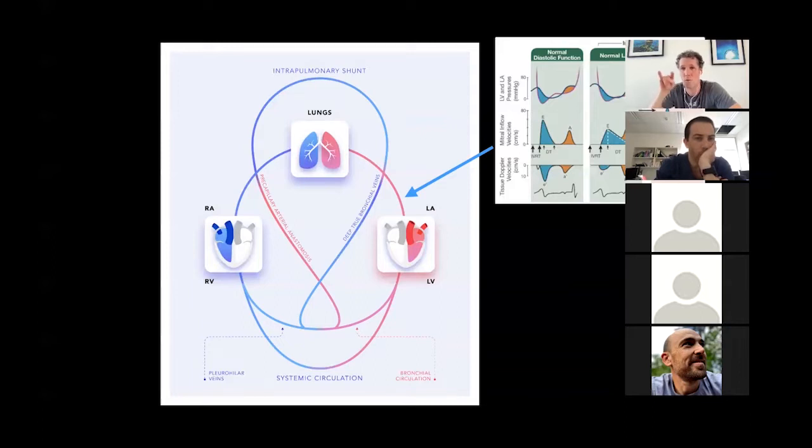So if I'm asking for normal left atrial pressure, you've got to say it's E to E prime less than 8. Okay. If it's over 8, it's in the gray zone. Over 14, that's very suggestive of raised left atrial pressure.